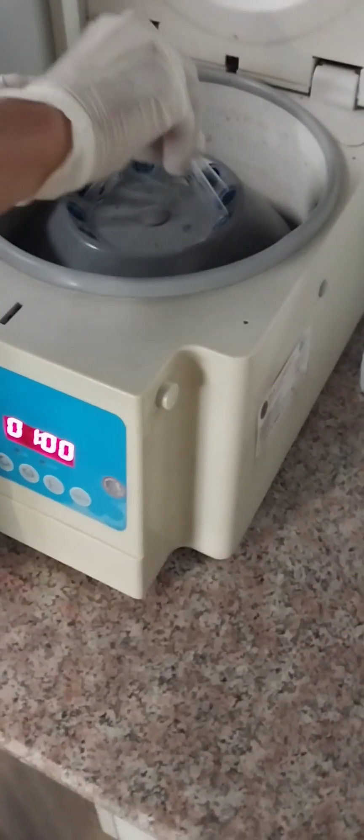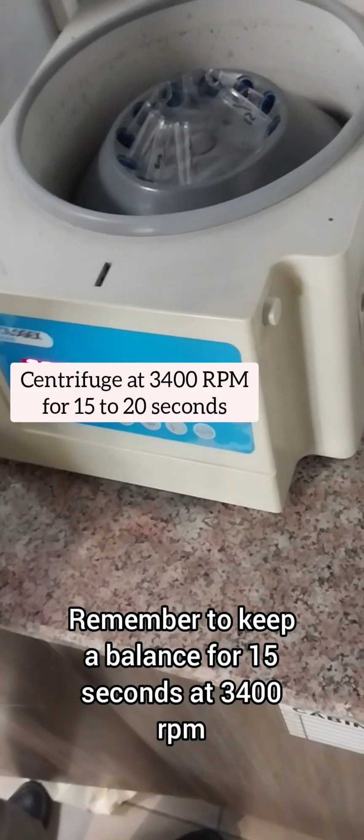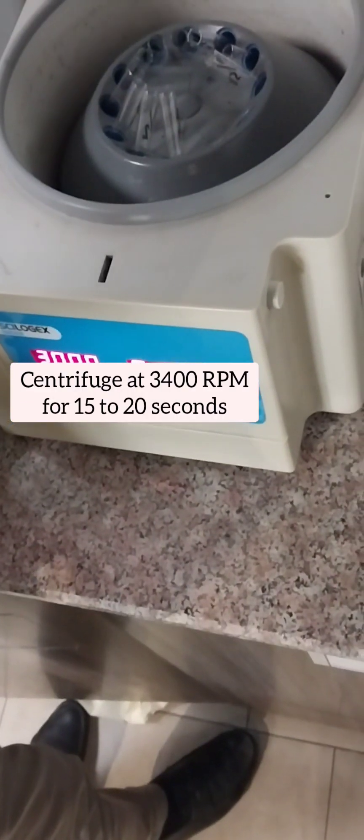Now we are going to centrifuge these tubes. Remember to keep a balance for 15 seconds at 3400 rpm.